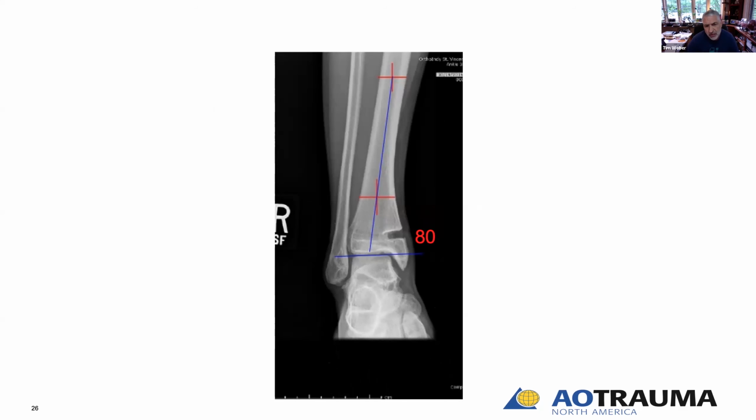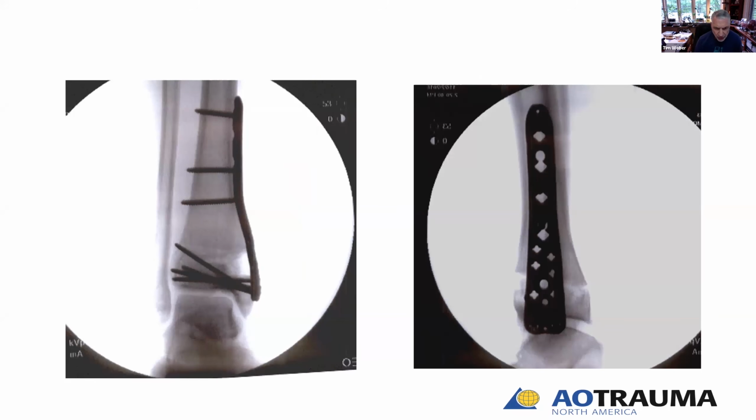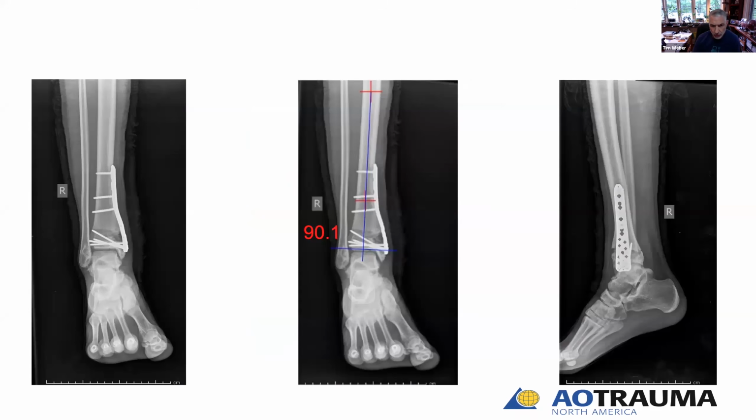Actually, if you look at this image here, you can start to get that sense of this widened ankle mortise here on the medial side. We ended up leaving his fibula intact, and unfortunately we probably had Johnny running the C-arm this day because we didn't get any of the images that we saved. But doing an opening wedge osteotomy of his distal tibia and leaving the fibula allowed us to not only correct his overall deformity, but also make his ankle mortise a little more symmetrical.